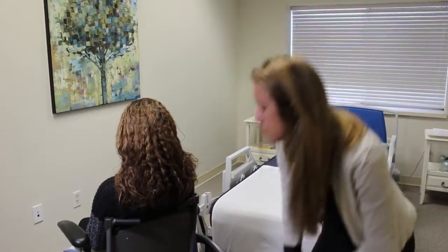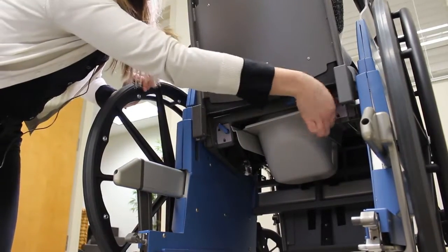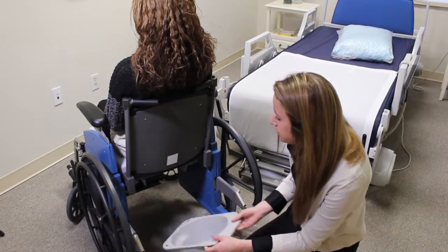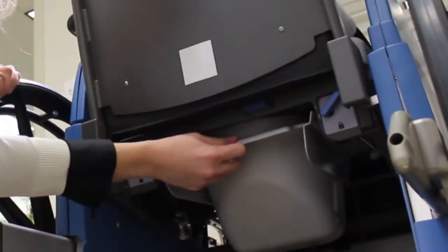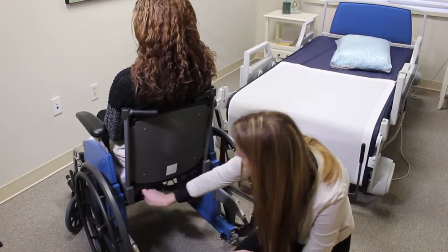Once the client uses the commode, you unlock the receptacle, remove it, dump and clean it as necessary. This is also an opportunity to clean the patient as well. You then push it back in and lock it once again.